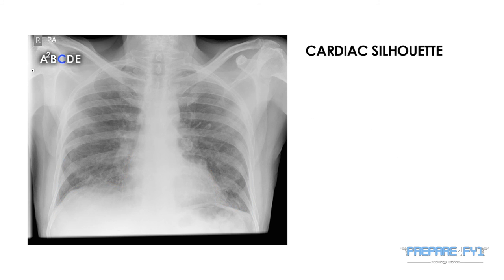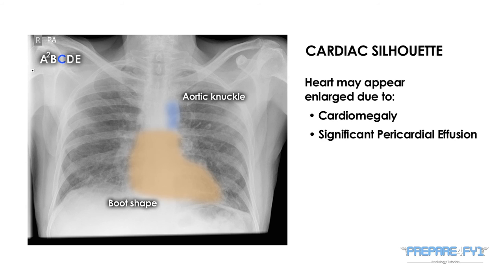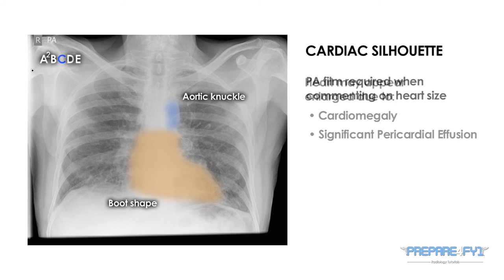C is for cardiac silhouette. Here you can see the boot-shaped cardiac silhouette with the aortic knuckle. The heart may be enlarged in pathologies such as cardiomegaly or significant pericardial effusion. You can only, however, classically talk about the cardiac size in the context of a PA film.